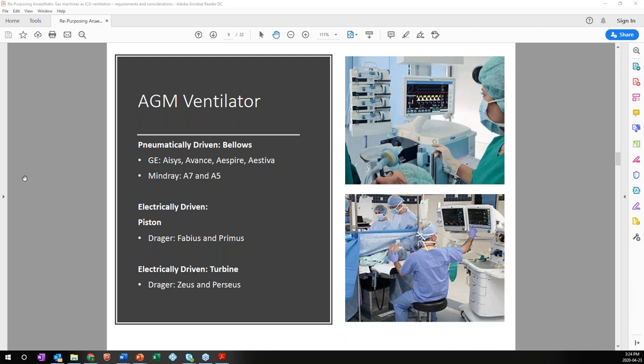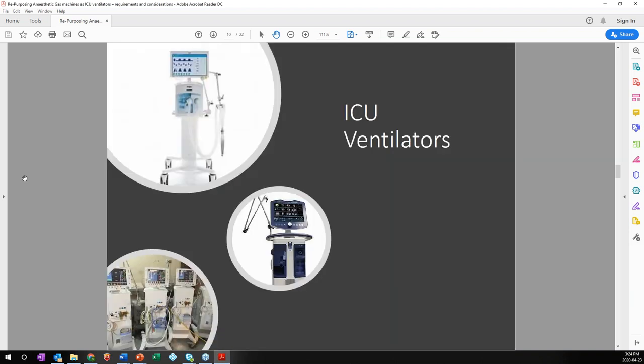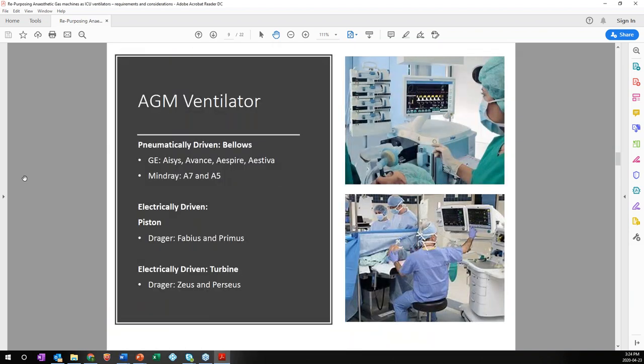So the other difference between the ICU ventilator and the anesthetic gas machine is the ICU ventilator does not rely on a scrubbing system to eliminate CO2. It usually has a heated expiratory filter that has an expiratory port. Gas machines also use a gas bench to constantly measure anesthetic agents and rely on electronically integrated pressure transducers, valves, and flow sensors that require calibration to ensure accuracy of operation and to prevent malfunctions.